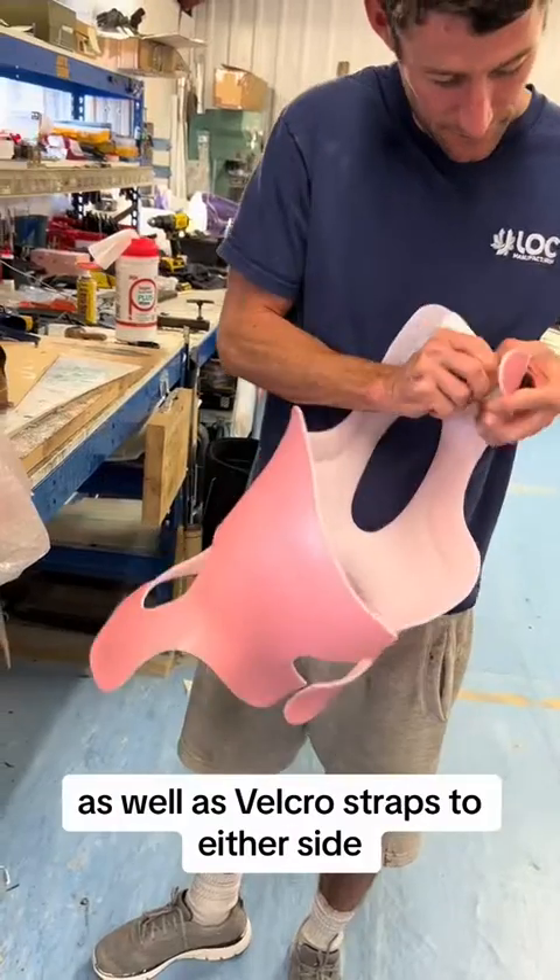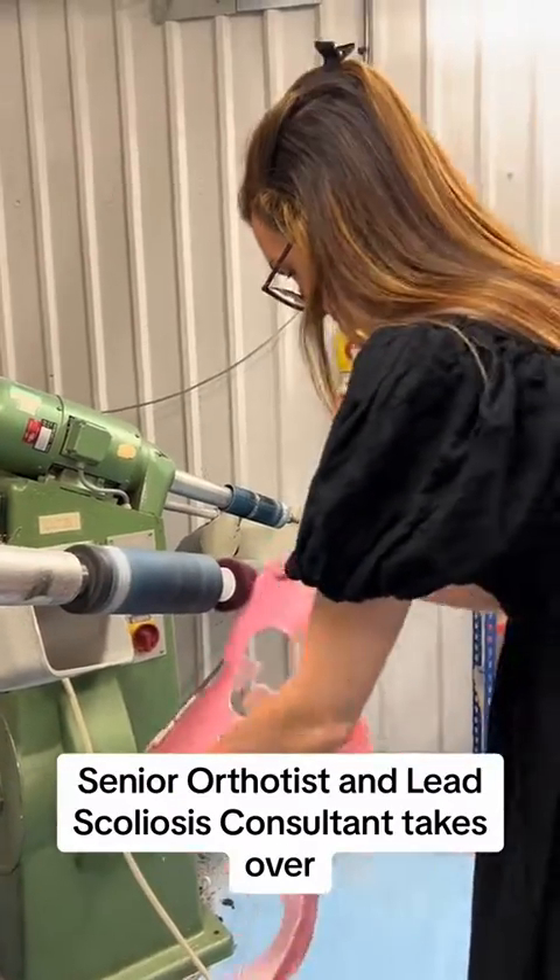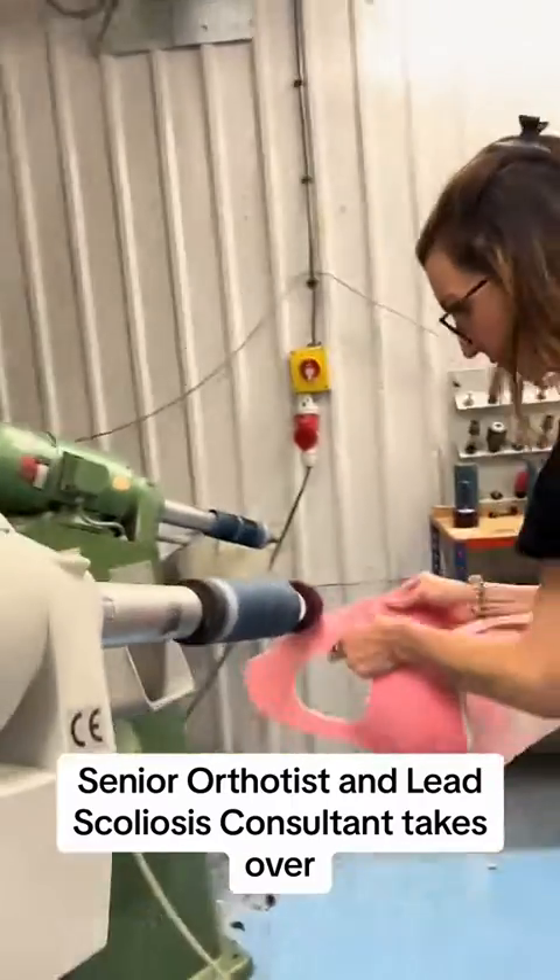We add padding for comfort as well as velcro straps to either side. Then Anna Courtney, senior orthotist and lead scoliosis consultant, takes over.